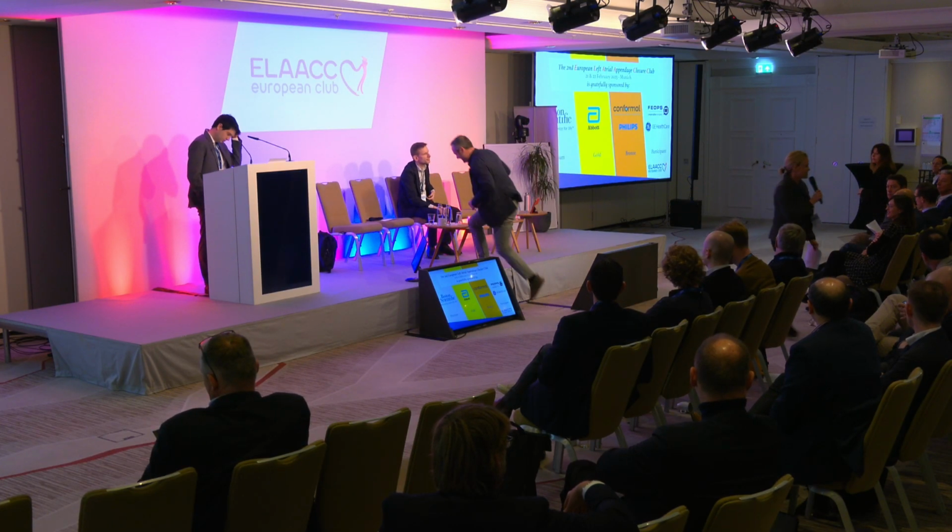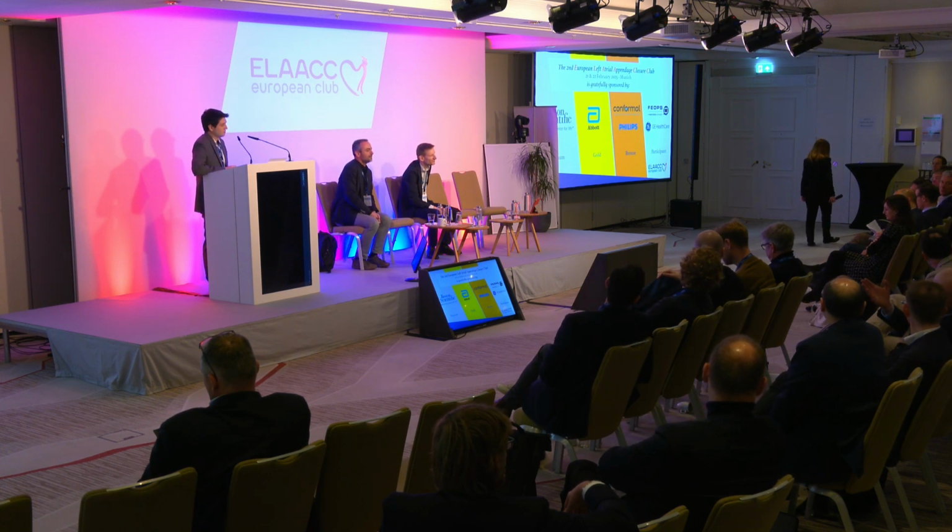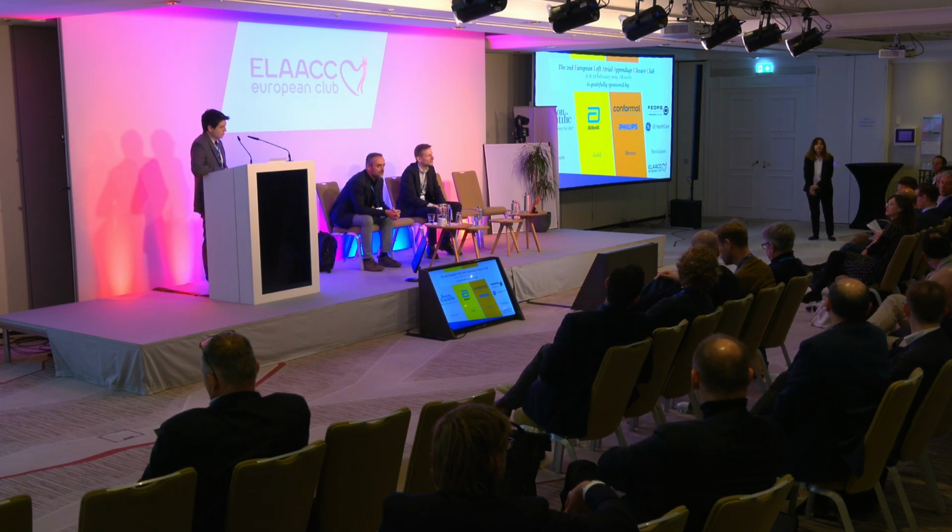Okay, I think we are definitely not at the spot where you want to be, but companies are working on that. They call it GEs here, I think. So blood speckle imaging or tracking could be a solution for the future. It's not fine enough at the moment to really reconstruct the flow within the atrium, which is a very low flow. So we are not at the point of what you can show at the moment. But I think companies are working on that, and it might be very helpful because this is something you can see immediately after the procedure. So I think the future is bright.